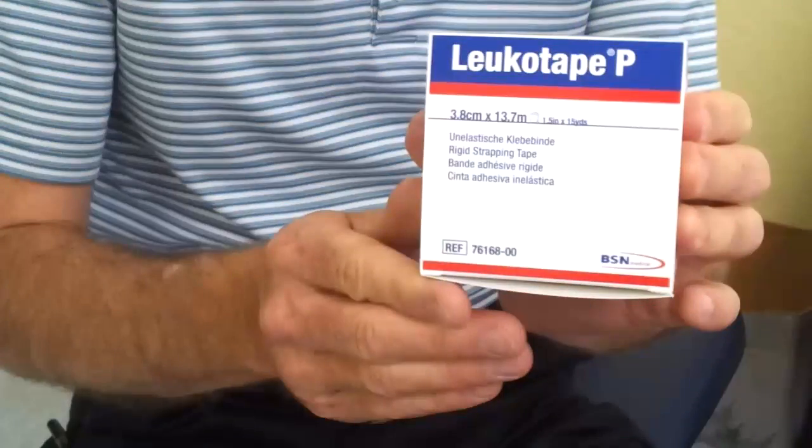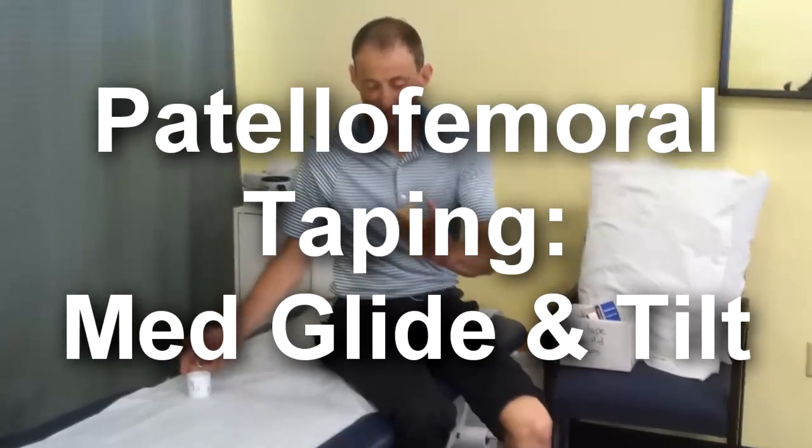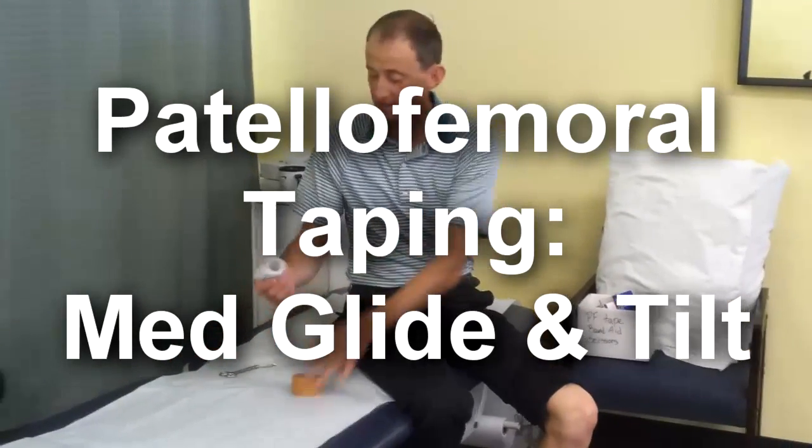You need two types of tape. This one is called Leukotape, and this other one is called Cover Roll Tape.